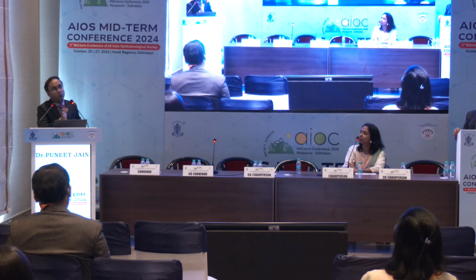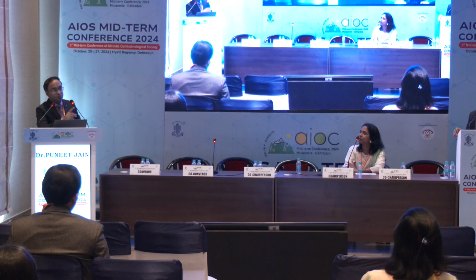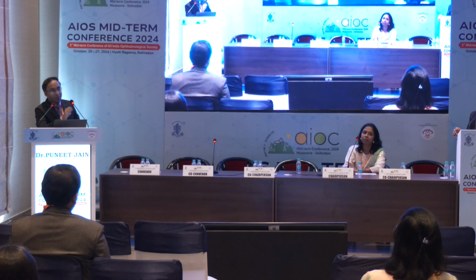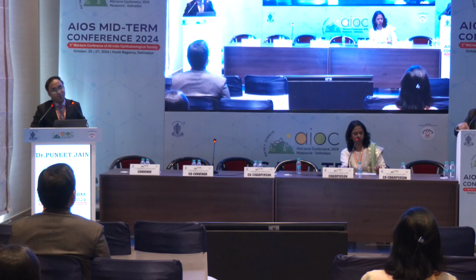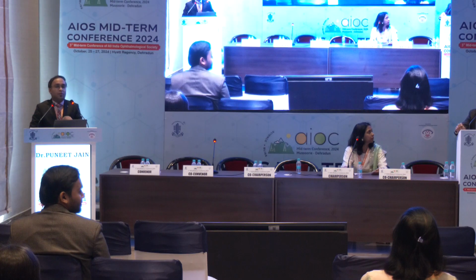I have about 7 years of experience. I'm still young in oncology, but I haven't had the need to go back to an ASOCT or a UBM to relate it with my histopathology. It can be the other way around. I am having a purple patch, I haven't yet come across a tumor like that. Yeah, I think this is absolutely a valid, good question, sir. Food for thought. We can go back and do a study on this.